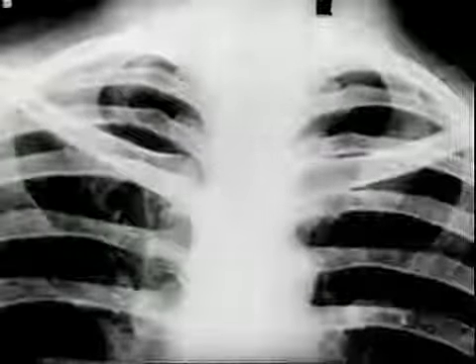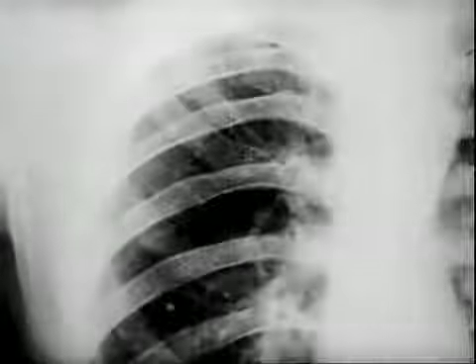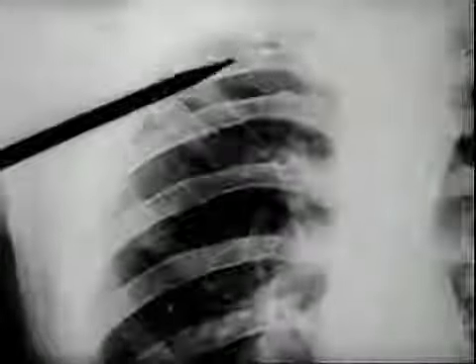In reinfection tuberculosis, this latent apical shadow gave no clinical symptoms nor any definite physical signs. This early infraclavicular infiltrate occurred in a medical student with only slight grippal symptoms and gave no obvious abnormal physical findings. This patient, markedly emaciated, had a profuse hemorrhage from the lungs. We expected to find great lung damage, but the X-ray revealed this minimal lesion in the lung.